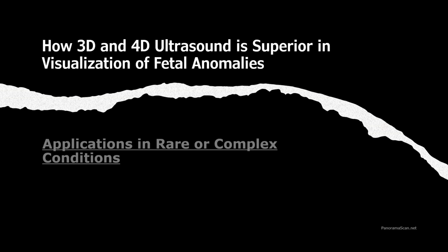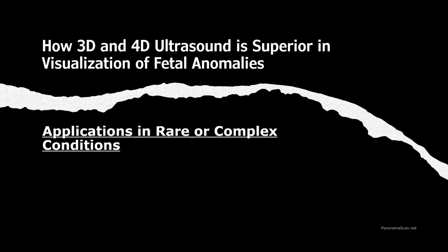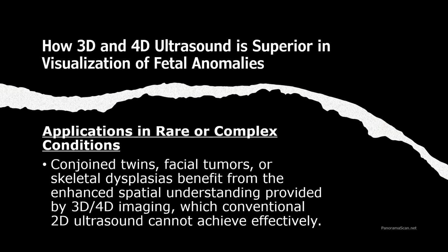Rare or complex conditions showcase the true potential of 3D and 4D ultrasound in fetal medicine. These advanced imaging techniques provide a much clearer spatial understanding of conditions that are challenging to assess with conventional 2D ultrasound imaging.